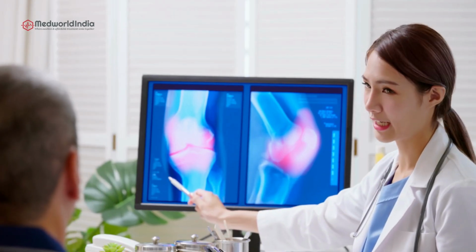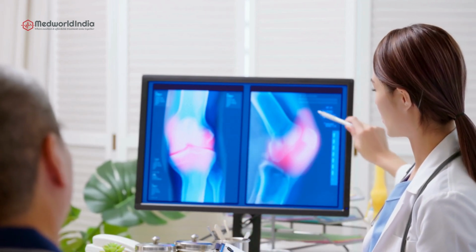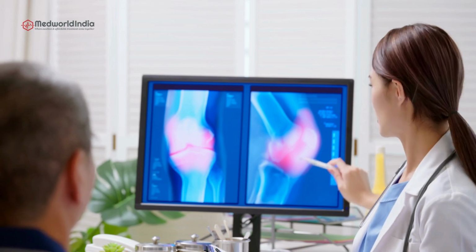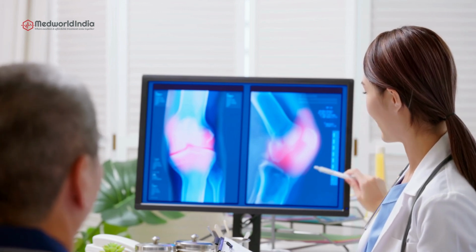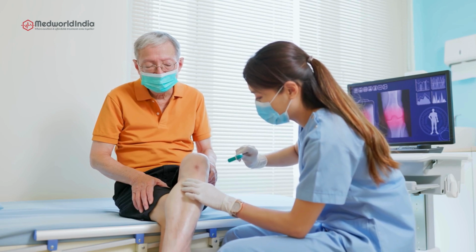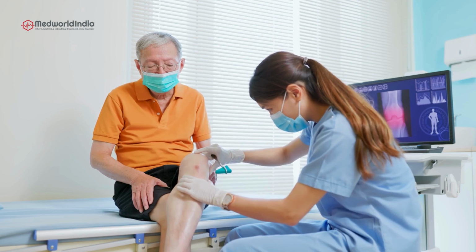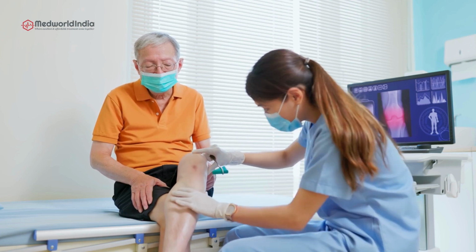3. Partial knee replacement, also known as unicompartmental knee arthroplasty, replaces only the damaged portion of the knee joint, either the medial or lateral compartment, with a prosthesis. Less invasive than total knee replacement with a shorter recovery time. May not be suitable for all patients, particularly those with significant arthritis in multiple compartments or ligament damage.